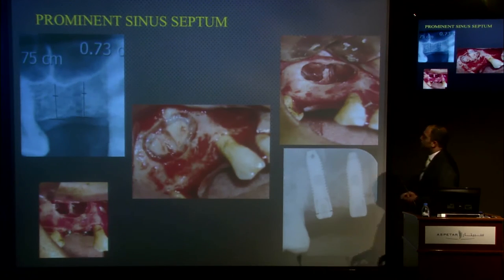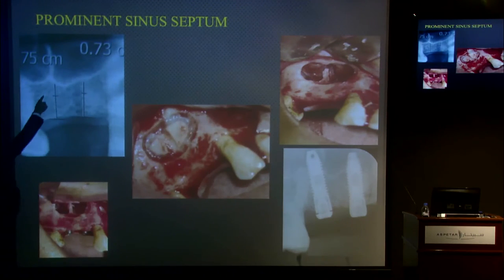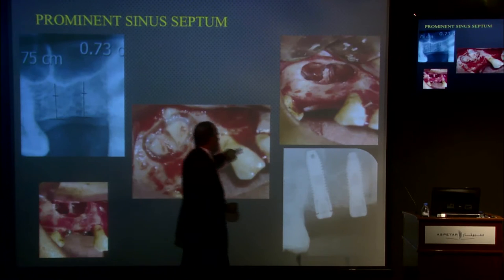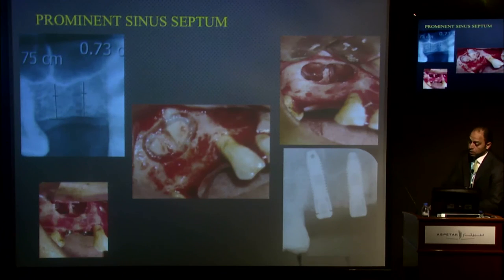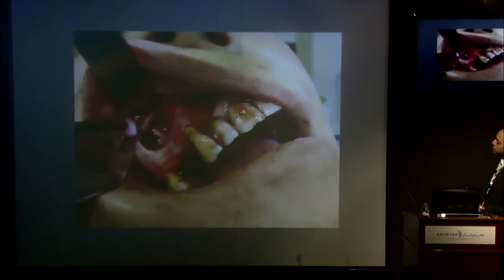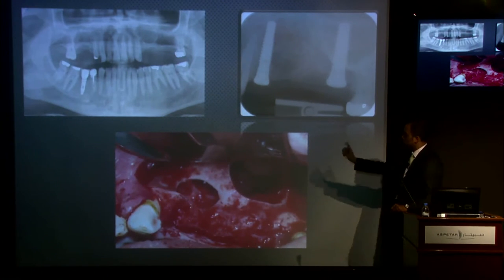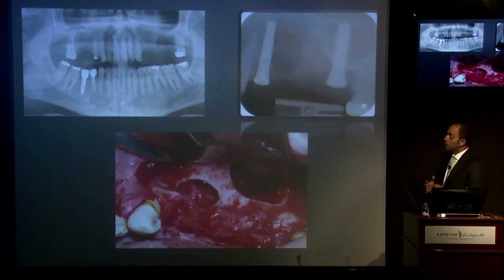Some cases have a prominent sinus septum. When this septum protrudes in the planned implant or sinus lifting area, we must make two lateral windows to approach the maxillary sinus and lift each window separately. We can check both windows for integrity the same way. We can preserve this septum to hold the bone in two compartments, or fracture it afterwards if worried that the sharp septum might injure the sinus membrane. In another such case, we made two separate windows and could see the bony island inside adherent to the maxillary sinus.